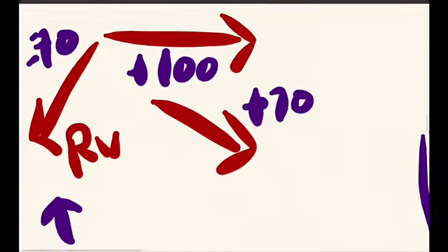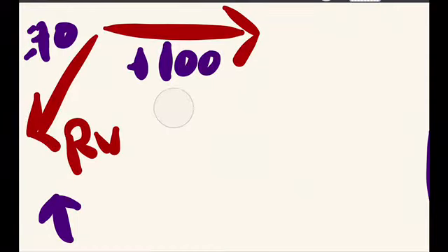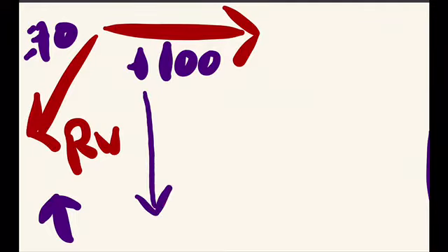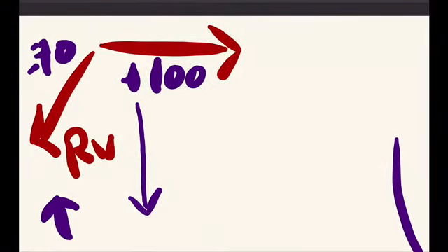Okay, so now the resultant vector will go more towards the right ventricle. The value will be +30. So the value will change, and that will be less positive, and by saying less positive, it means it will be more towards the right side.